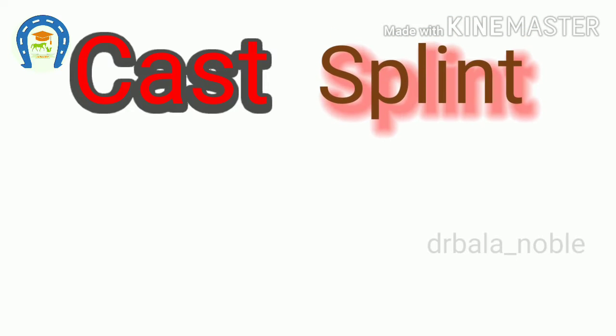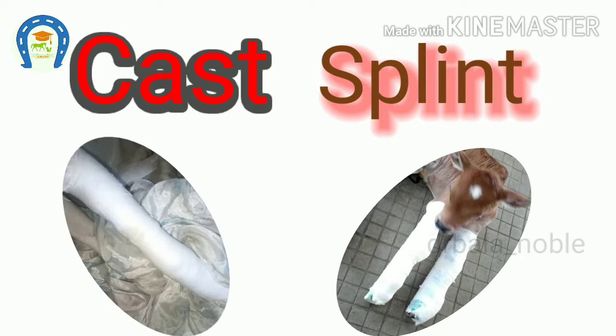So when to use a cast and when to use a splint? The cast gives more support and protection to the injured part than a splint. In case of acute injury, when the body part is swollen, we should apply a splint — we can tighten or loosen it easily if the swelling increases or decreases.